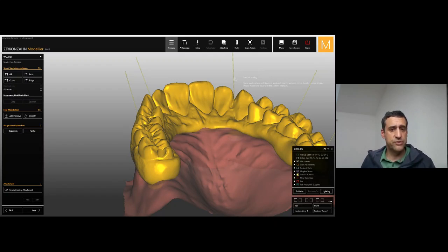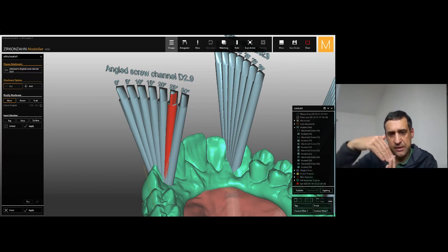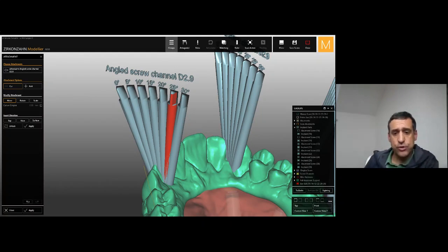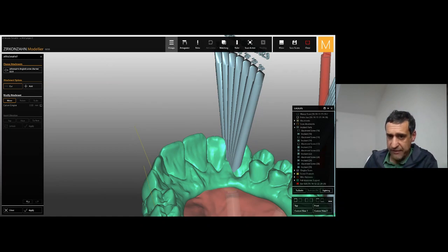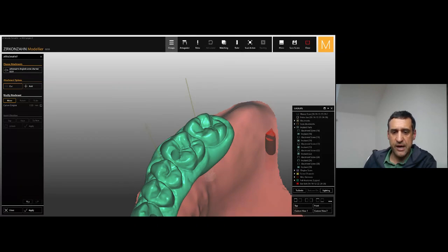So remember, when you select this one, when you finish it, the framework is merged, and you can select the channel screw and stamp it in directly. In this way, once you match, the connection between the T-base and the channel screw is correct. It's absolutely perfect, also during the milling, without any problem, okay? So for every one of these frameworks, I can match with a different inclination, of course, and then stamp the hole into my framework.